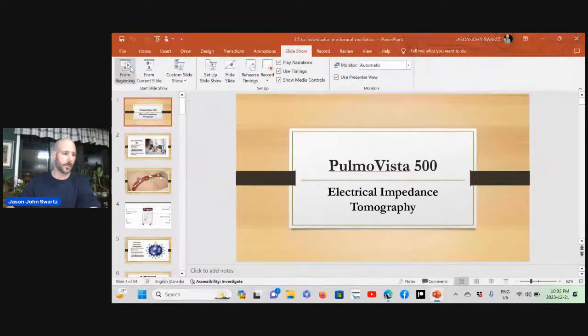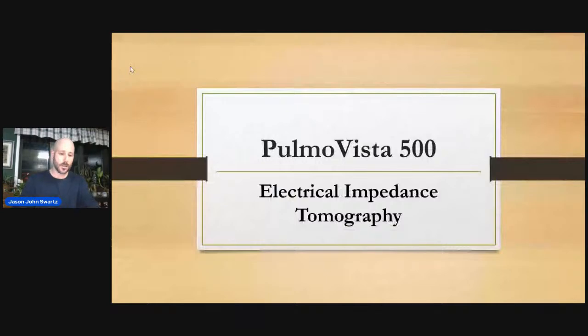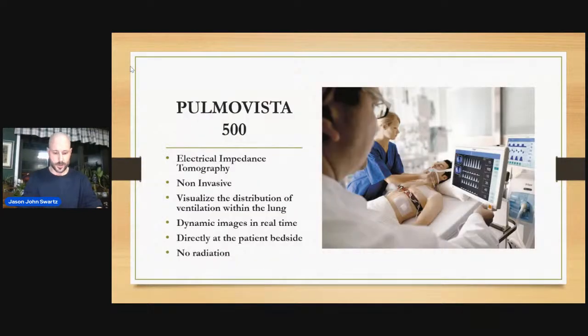All right, start from the beginning. I'm just going to play my video here, just to make sure I know what I'm looking at. Bear with me, guys, for a second.